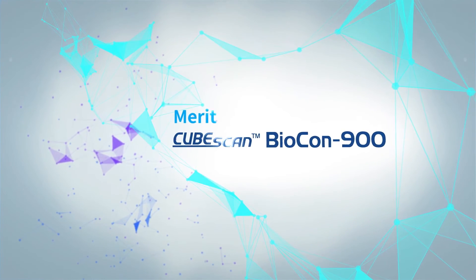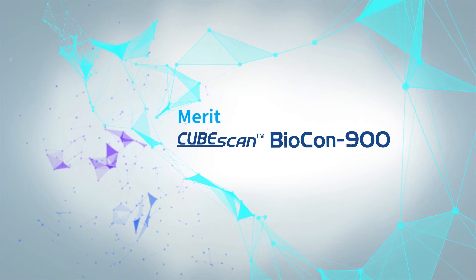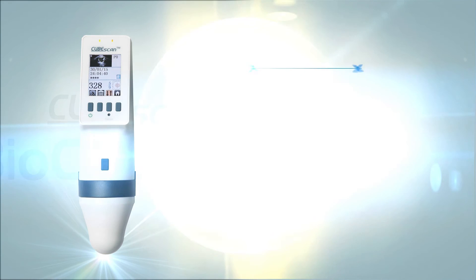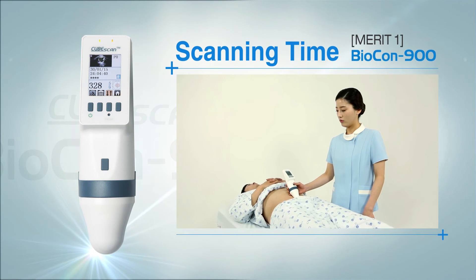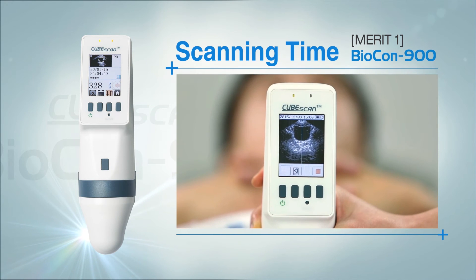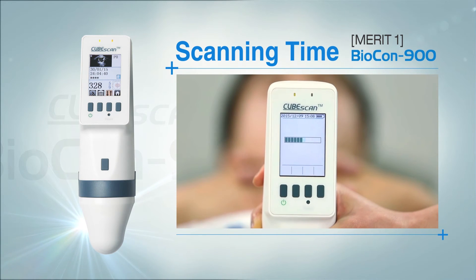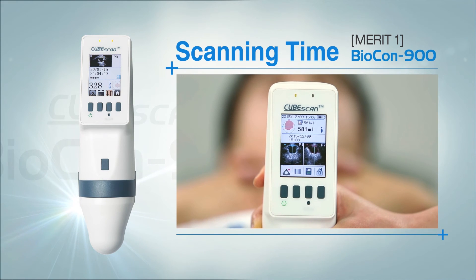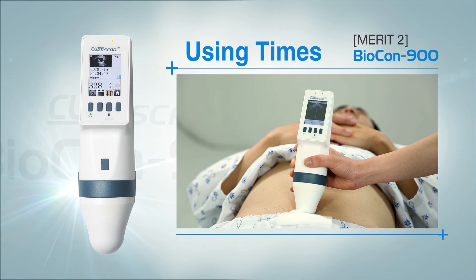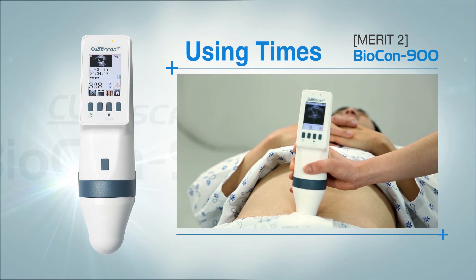The latest CubeScan series, Biocon 900, has the following features. First, it has a short scan time. By pre-scanning, scanning will be complete within 3 seconds from the point where the bladder becomes biggest.